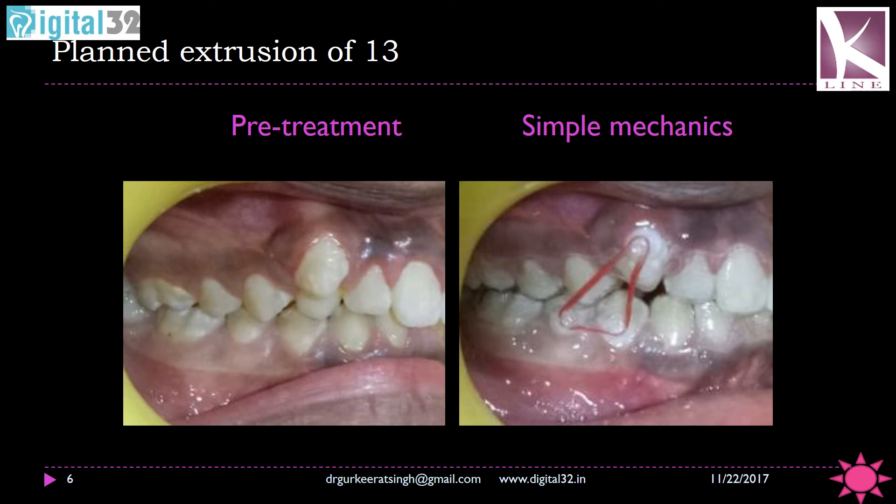These are simple mechanics. You can make out that we have a case where we have to extrude the maxillary canine, and we are utilizing two buttons on the premolars and giving a kind of V-shaped elastic to bring the canine into place. The two important things are that there should be a gap for the extrusion of the canine, and the same should be communicated — where the button is going to be located — so that space can be left for the fabrication of the button and the aligner should not impinge either on the button or on the extruding tooth.